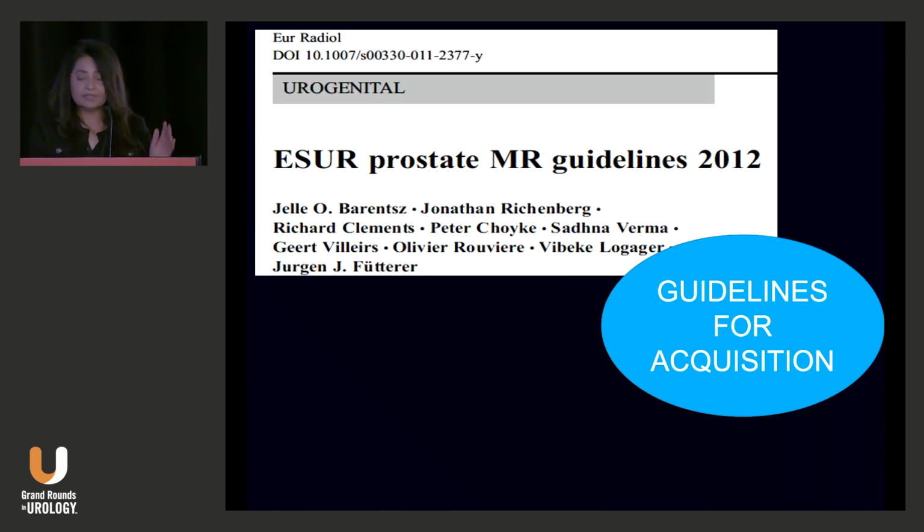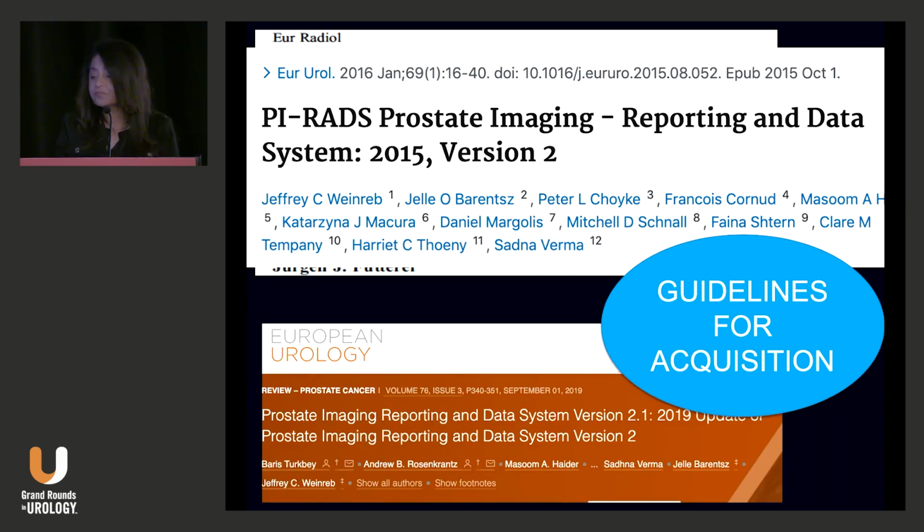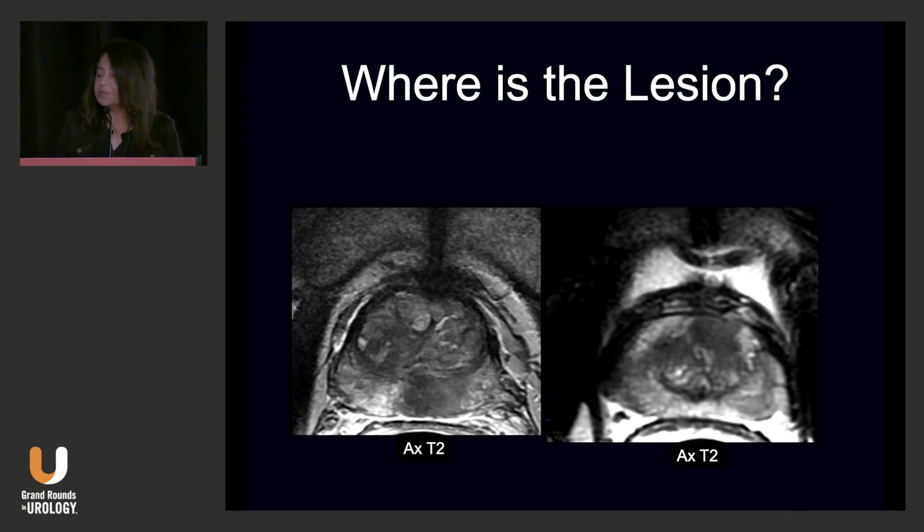Guidelines, so the guidelines have started a long time ago, right, in 2012, but then the most recent one, PI-RADS 2.1 gives you nice images, examples. So it's on the ACR website.